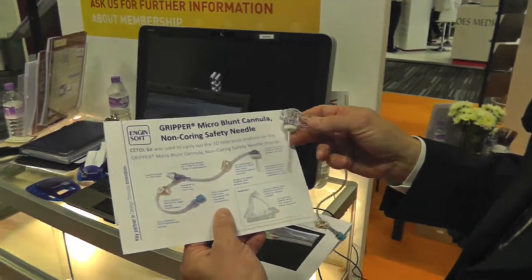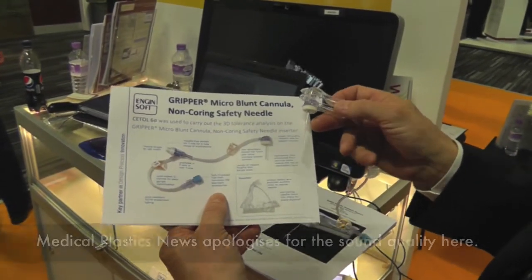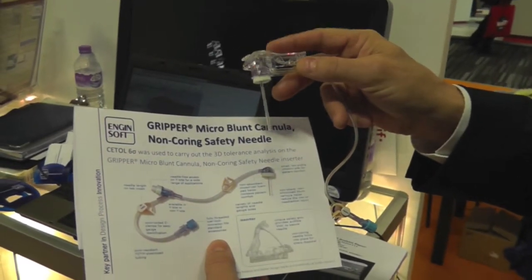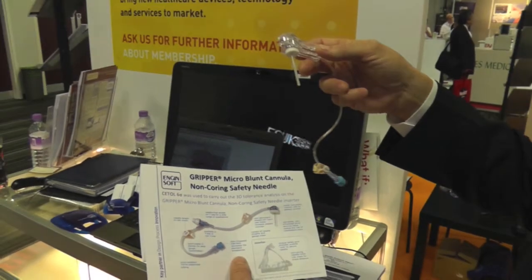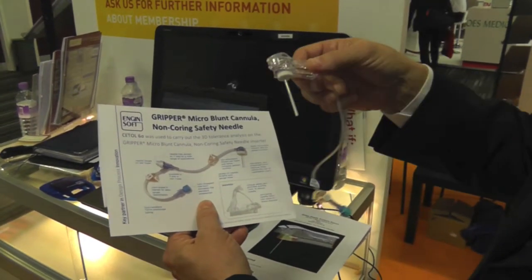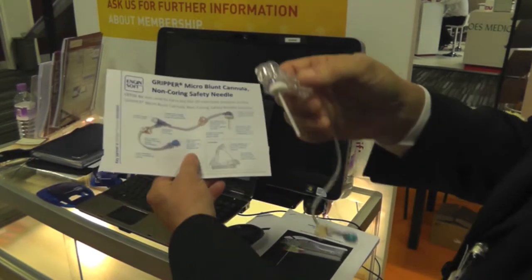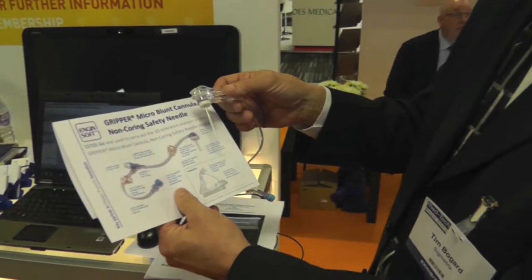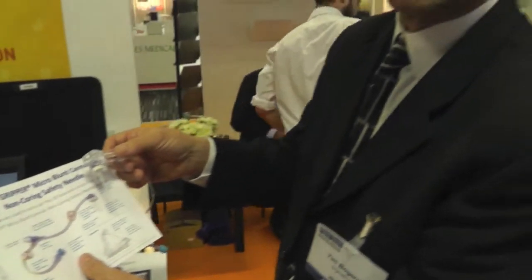So as an example, here we have a device that we've worked with, which is a port for an infusion pump, and you can see the actual device itself here, and you can see the extender. And what this port does, it allows a patient in their home to actually apply and place the port in their arm, leg, wherever it's supposed to be, so that they don't have to go to the clinic all the time in order to get this port applied. So it's about taking designs and making sure they're patient ready, that they're safe, they're reliable, and they're basically fail-safe.